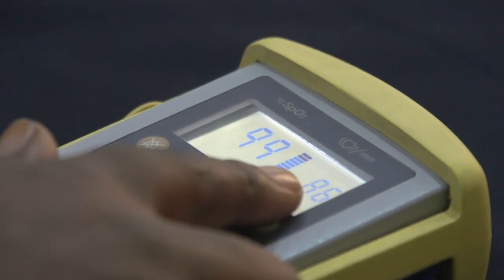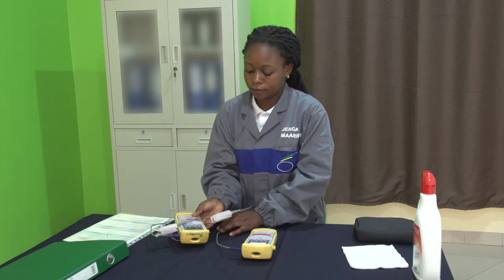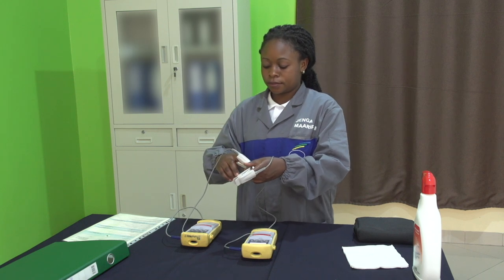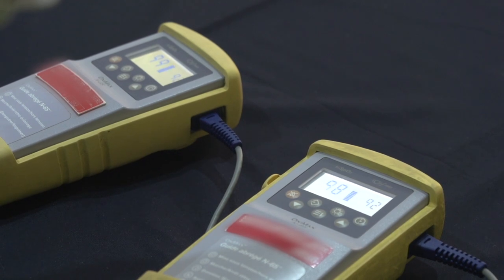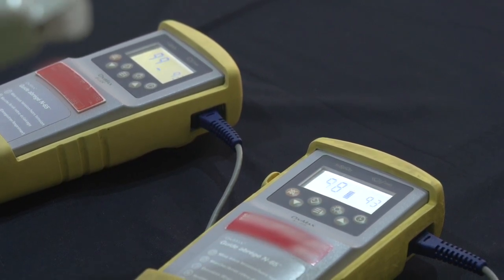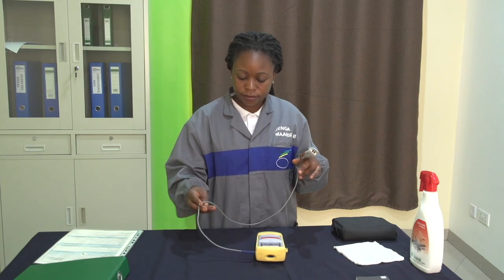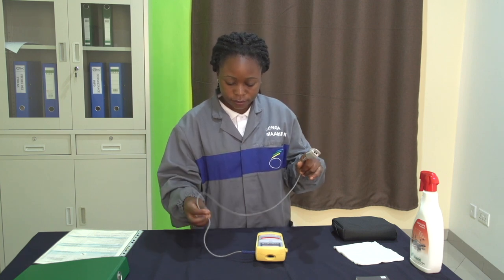Ensuite, on va vérifier la crédibilité de ces mesures par comparaison aux mesures habituelles ou à l'aide d'un autre oxymètre de pouls. Par exemple, on vous montre que quand on se connecte sur un autre oxymètre de pouls, on a bien les mêmes valeurs qui s'affichent à plus ou moins 3%. Pour vérifier la fiabilité du capteur, on va reconnecter le capteur sur notre doigt et faire bouger le câble afin de détecter d'éventuelles coupures.